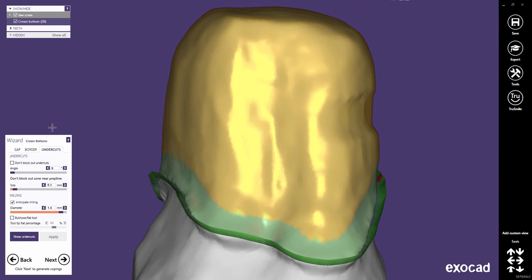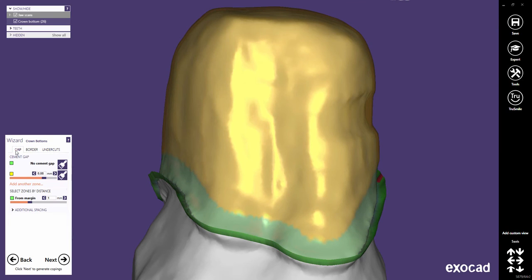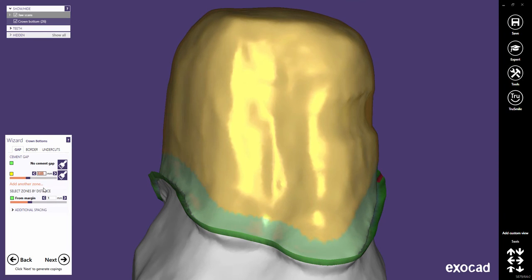In the standard 5-axis configuration, changes in the cement gaps will usually be computed and visualized in real time.